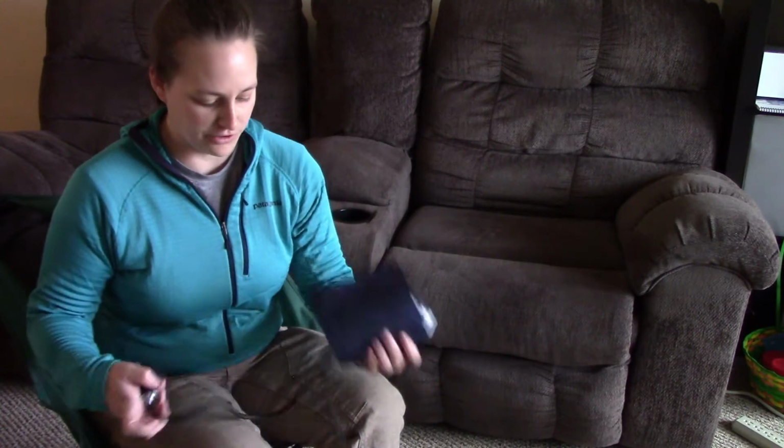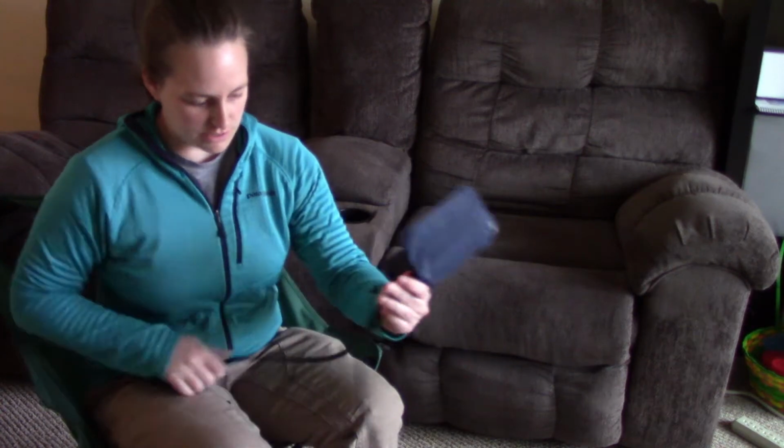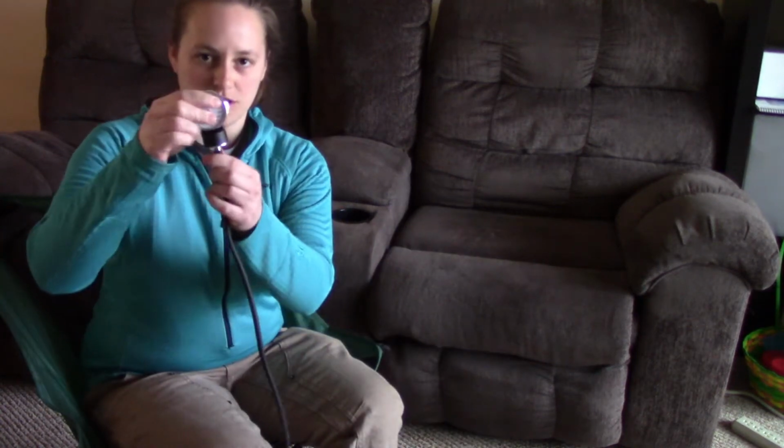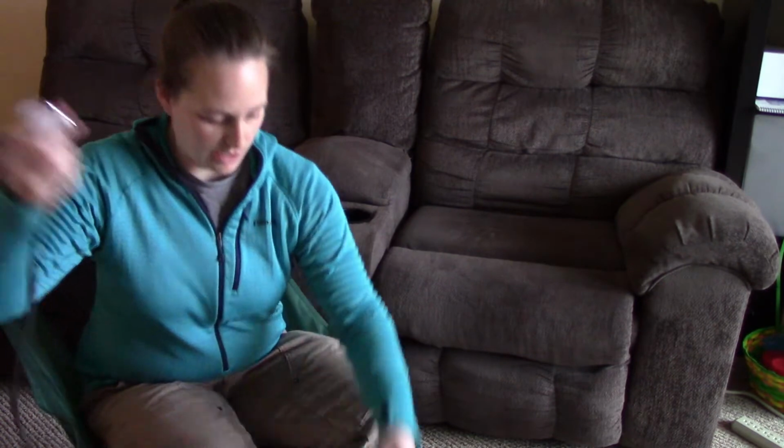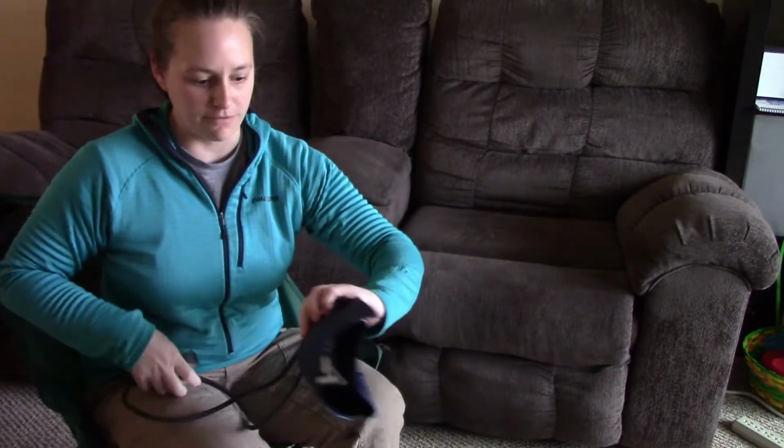Alright, welcome. We're going to talk about how to check a blood pressure today. So the first thing you want to check is that you have all your equipment assembled correctly. If you have a new blood pressure cuff, you may need to attach the gauge and the bulb to the ends of these tubes that are built into the blood pressure cuff.